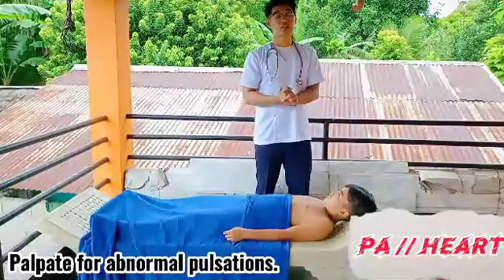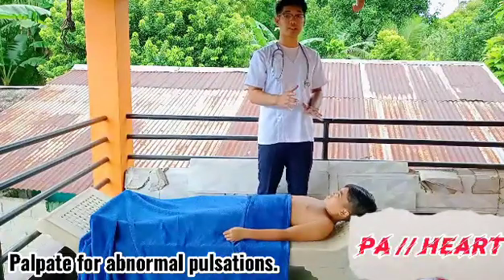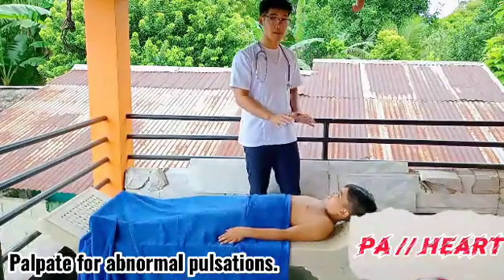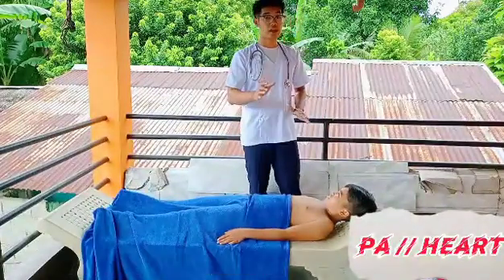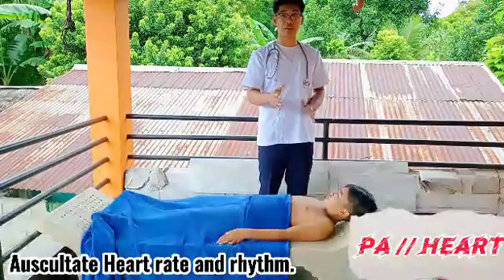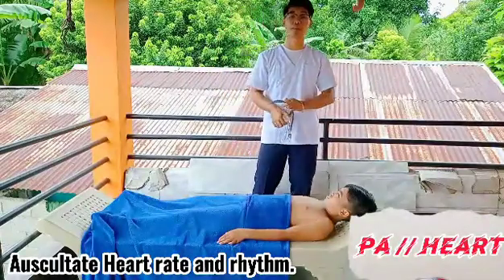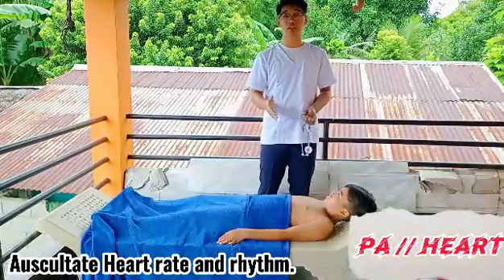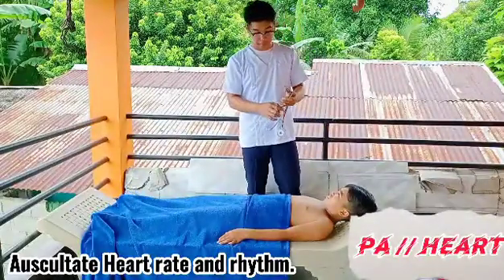Okay. So based on my palpation, there is no pulsation or vibration palpated in the areas of the apex, left sternal border, or base of the heart. Next, we will move to the auscultation of the heart rate and rhythm. Okay? We are going to place the diaphragm of the stethoscope at the apex and listen closely to the rate and rhythm of the apical impulse.